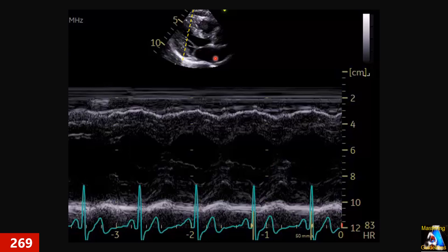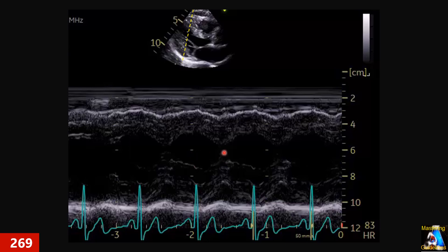Here we have a PLAX M-mode. The tech did this view, placed the cursor this way, and gave us this M-mode. First of all, is it correct or not? Second, can we measure the wall thickness — septum and posterior wall — on this M-mode? Will it be accurate and correct, or not? What is the problem with it?